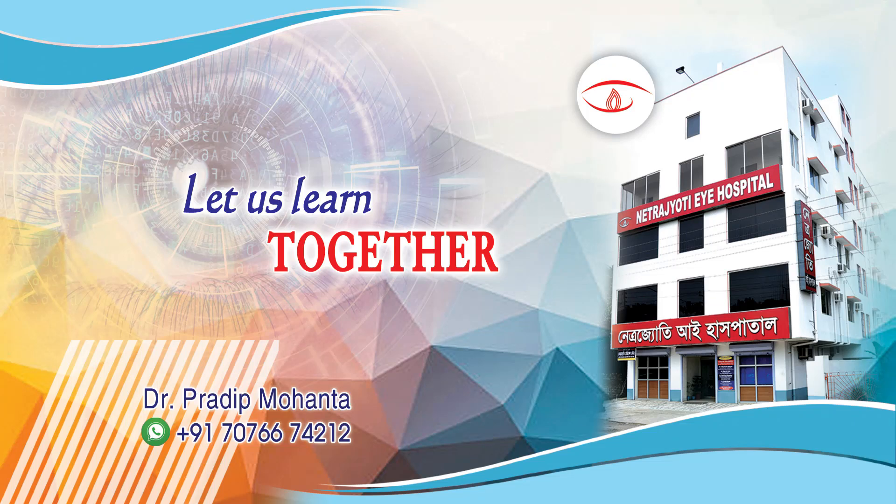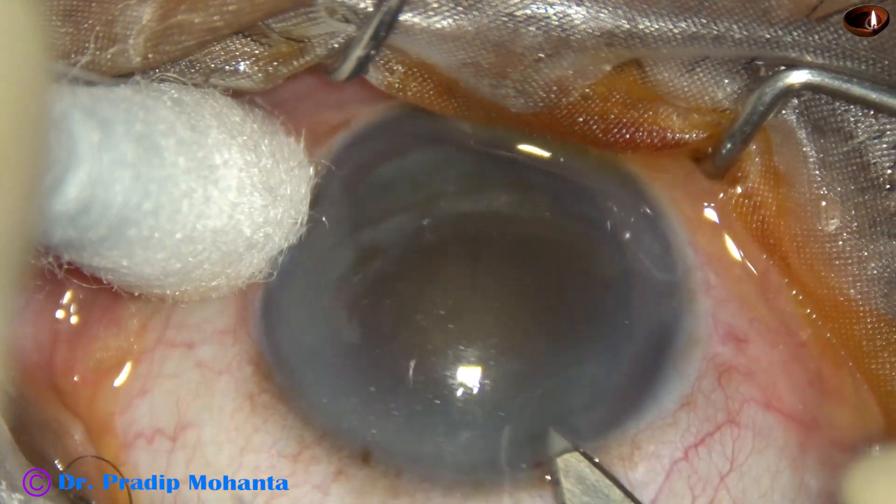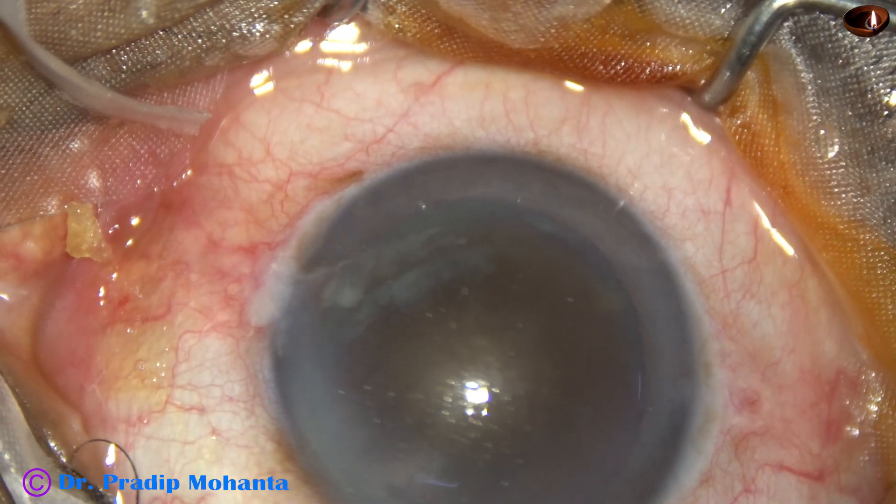Friends, welcome to my workplace at Ranaghat, West Bengal, India. Let us observe phacoemulsification of this hard cataract. Nuclear sclerosis is about grade 6.